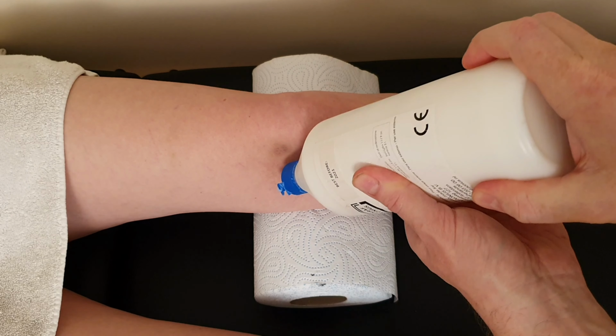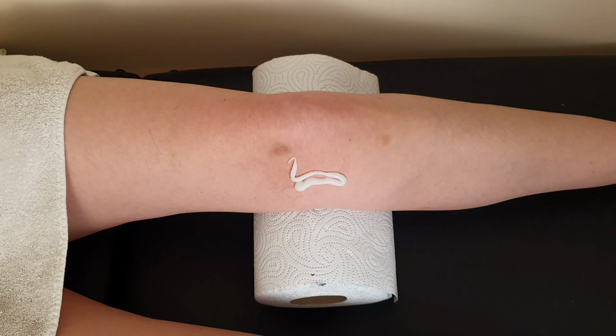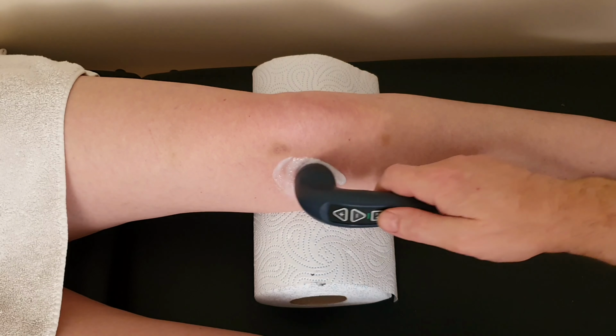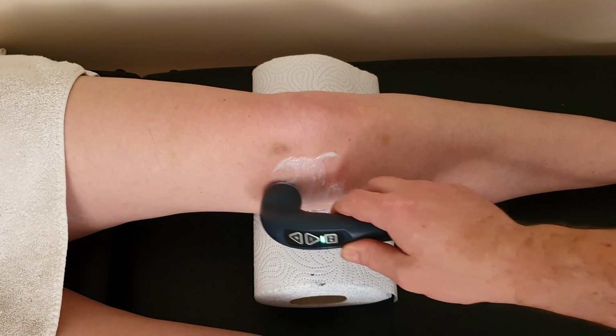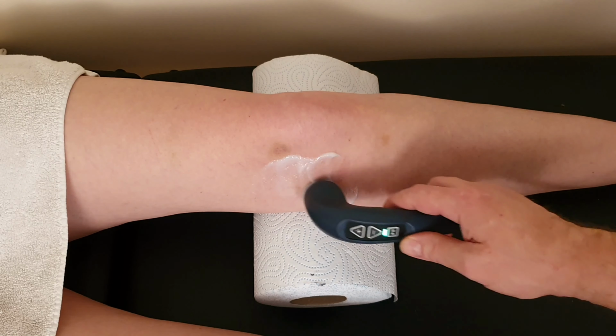A little bit of contact medium down the edge of the MCL where I want to treat here. I usually put the contact medium along the area I want to treat. Always use more rather than less. I tend to find it dries out during the treatment. The skin seems to absorb it. Start the machine here and start going around in small circles fairly rapidly. This area is going to absorb the capacitive waves very rapidly and readily, so it'll heat up fairly quickly.